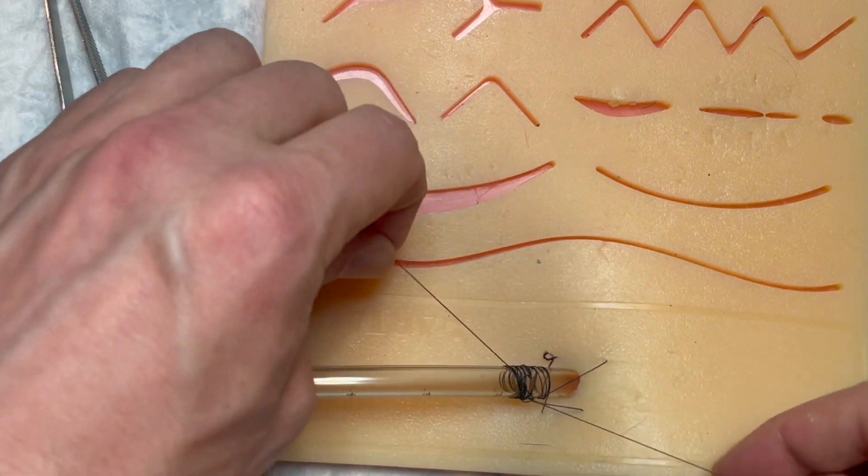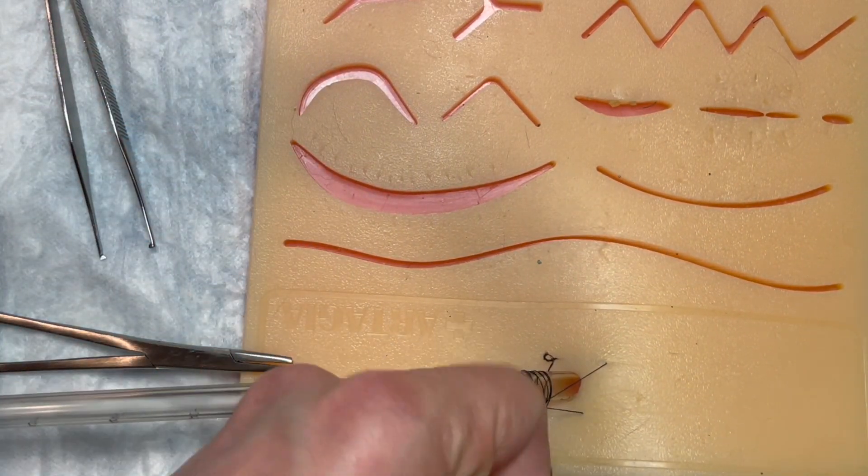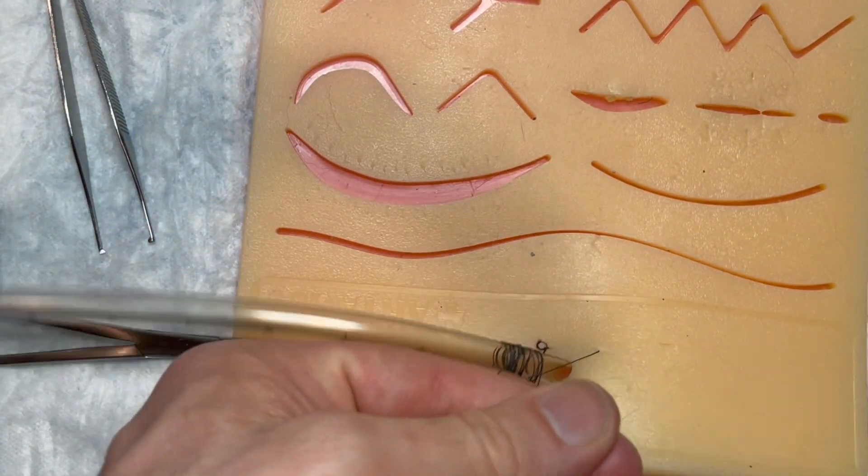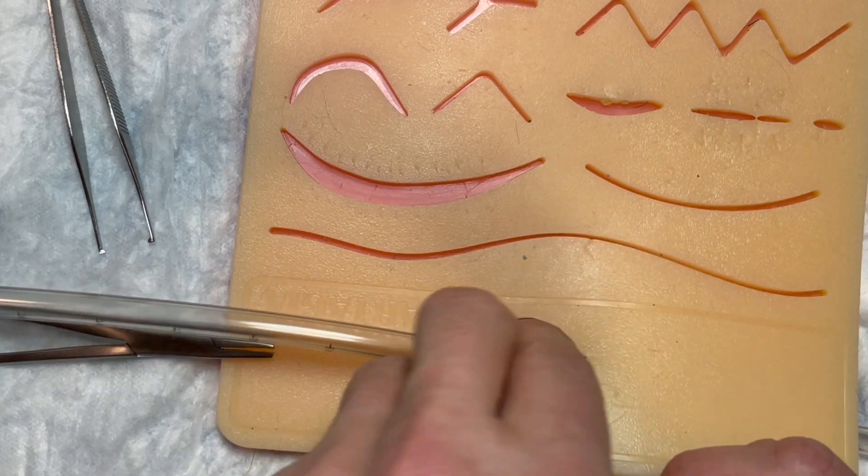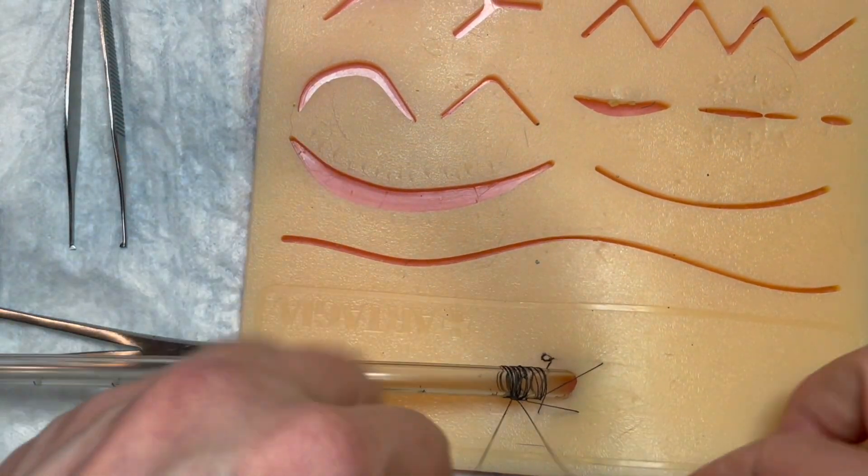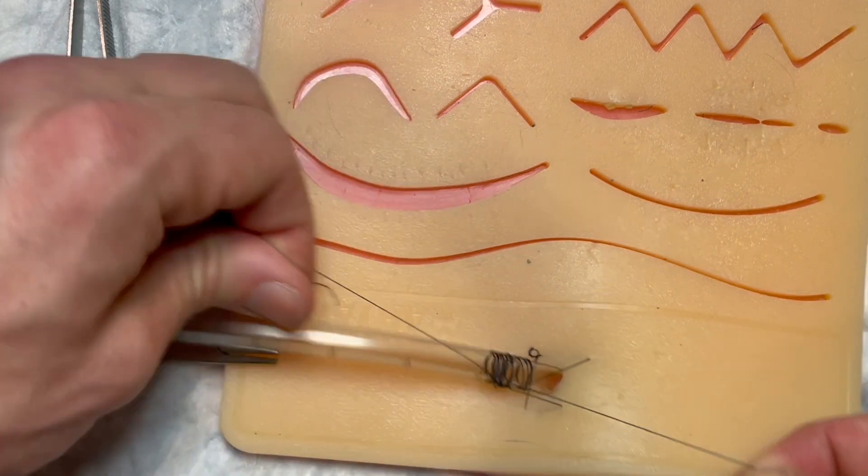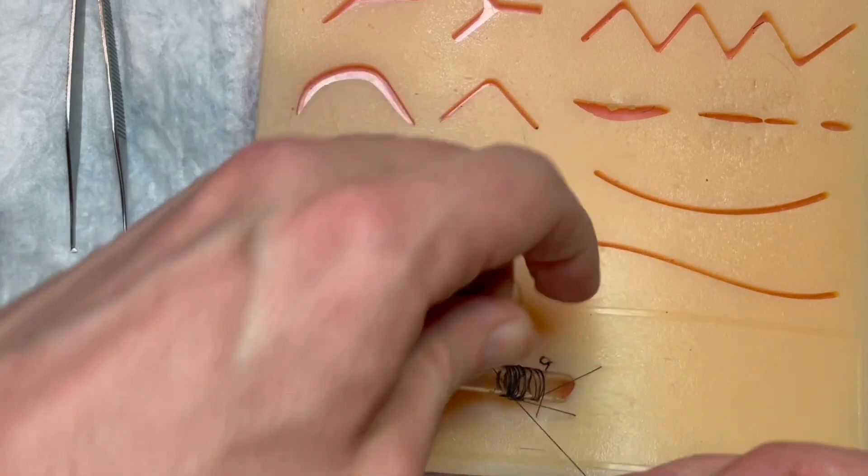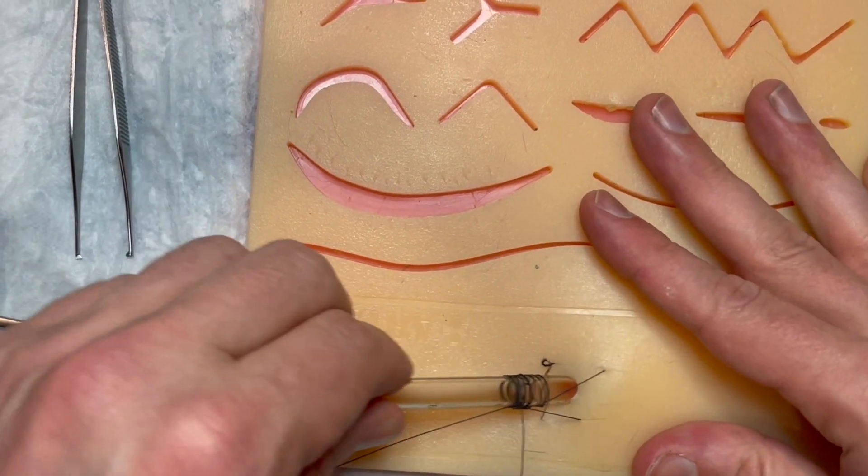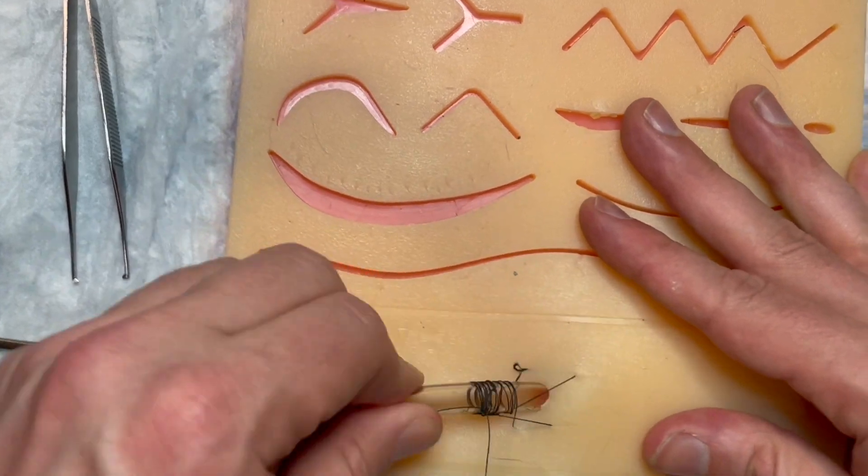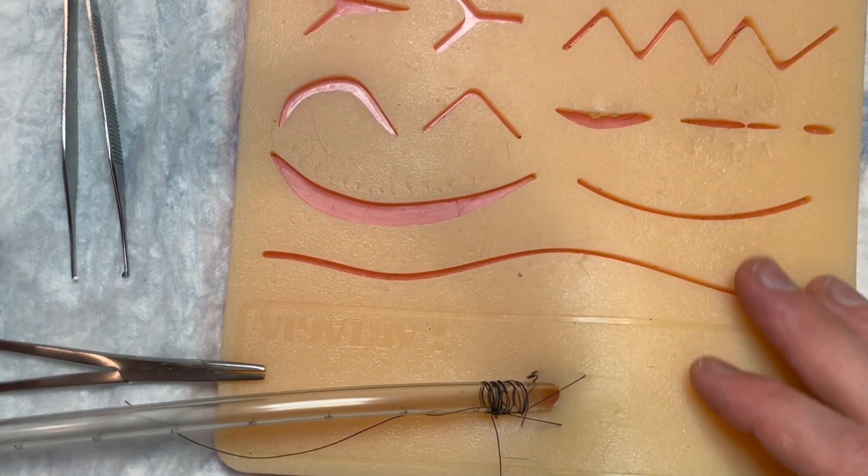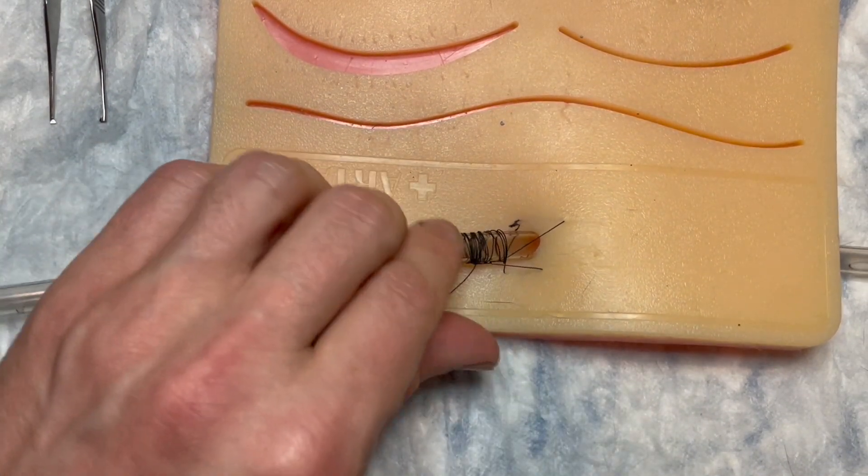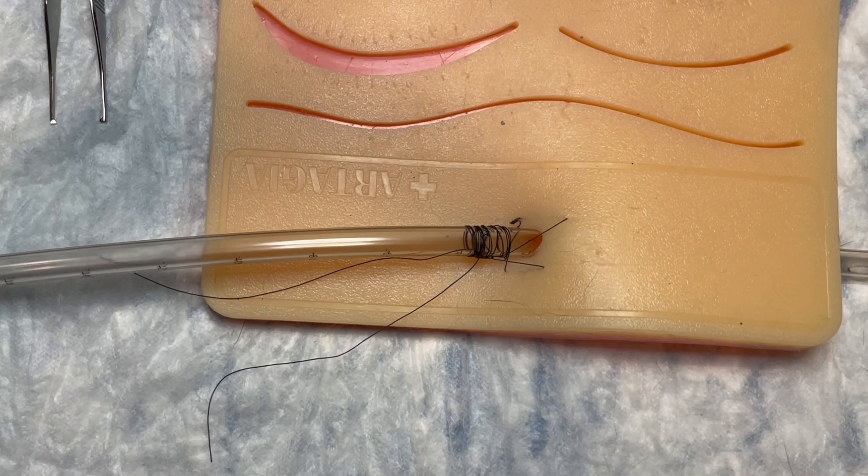All right, so now we've got this and we can just do our simple little tie to finish it off here. All right there we go, this guy's not going anywhere, super secure. And the beauty of this guy is when it's all said and done, and normally from the emergency room we're not really undoing our chest tubes, but we can start cutting away.